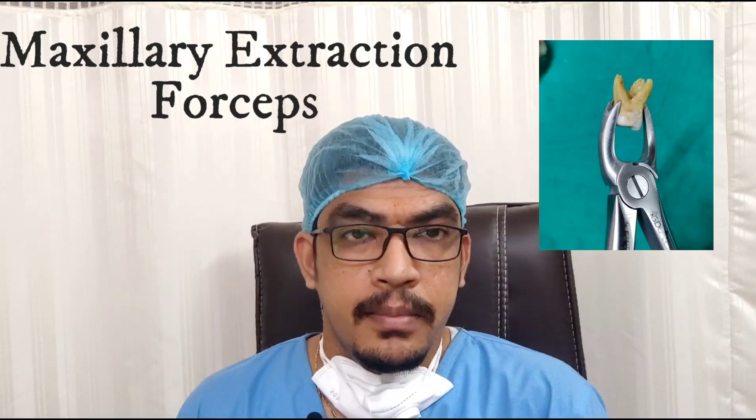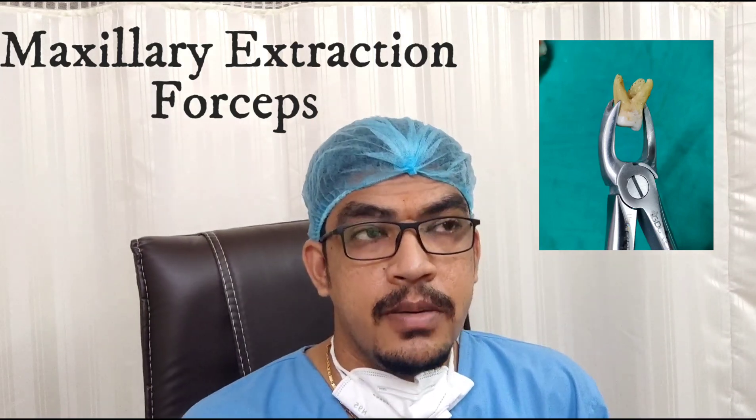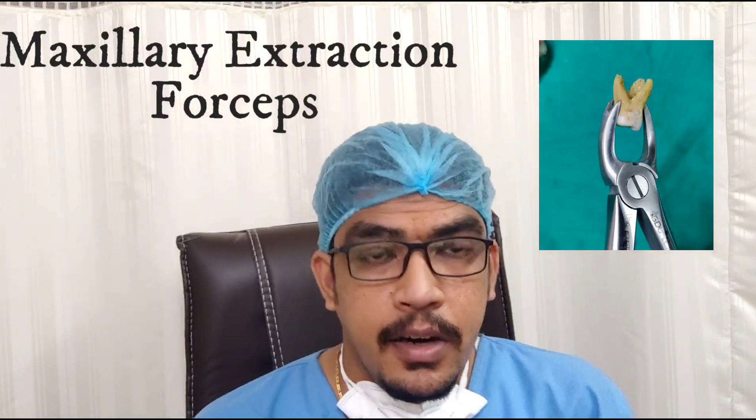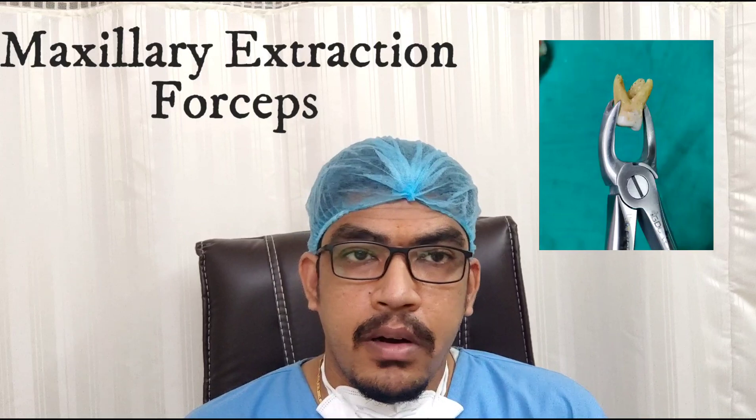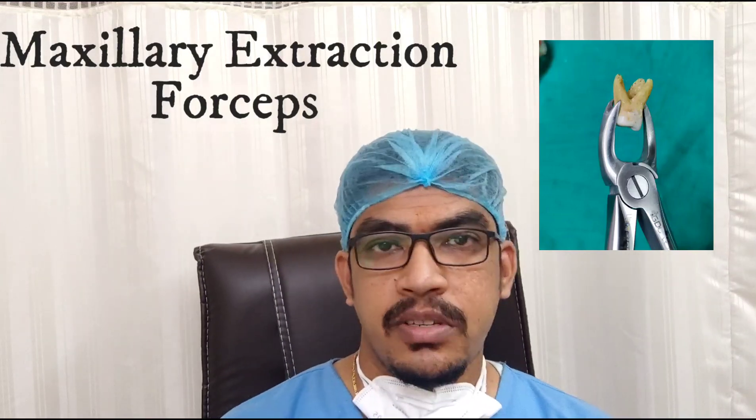Good morning everyone. I am Dr. Varun Pandula from Wisdom Super Specialty Dental Clinic on behalf of JuniorDentist.com. Today we are going to talk about the Maxillary Extraction Forceps.